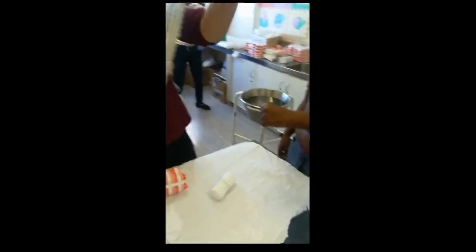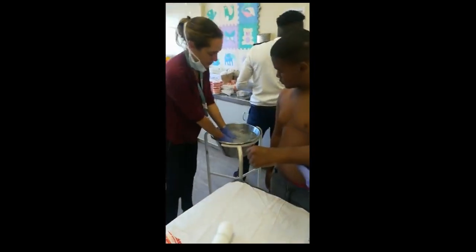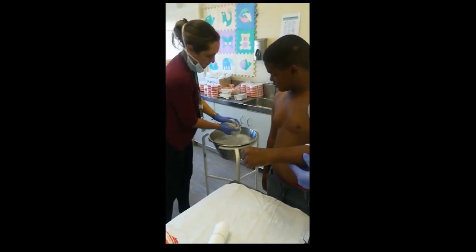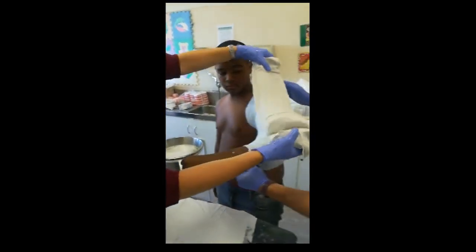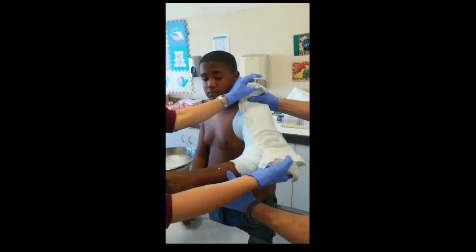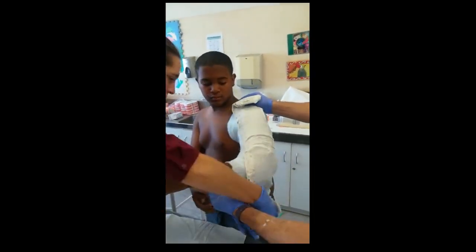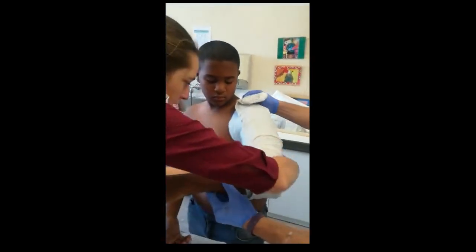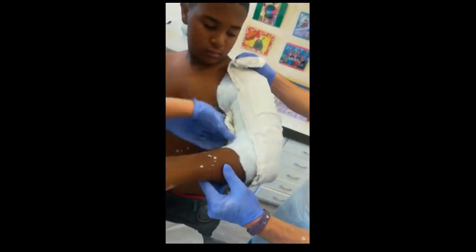Next, you take your slab which you've prepared and dip it in the water. Give it a nice squeeze. This is the part where you really need help, so my assistant is going to hold the cast up there. Notice that I've got an additional little length of the slab here — you'll see why in a minute. Then you wrap it around the bottom of the arm like this, and this is where the word U comes from, because the cast forms a U shape around here.